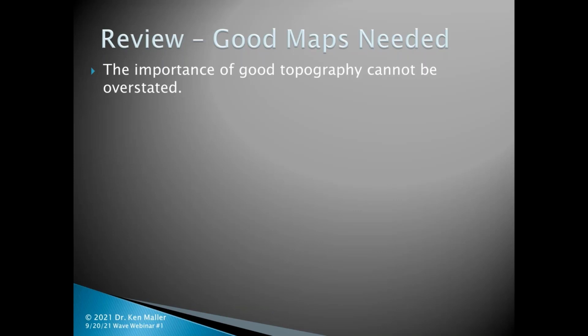And if you are not the one who is taking the topographies, it puts you at a disadvantage because you were not part of the actual capture process. And so you have to be even more discriminating when you are given these maps in isolation of seeing the patient, kind of like if you were doing a refraction and you didn't hear how the patient responded to the difference of a quarter diopter.